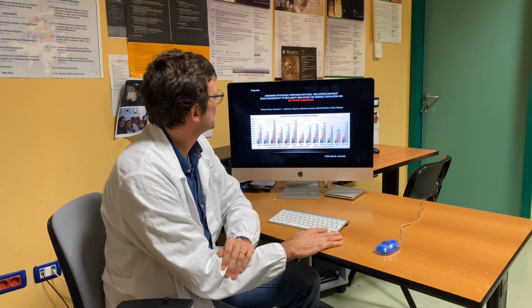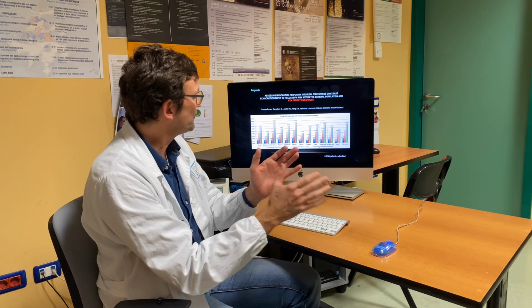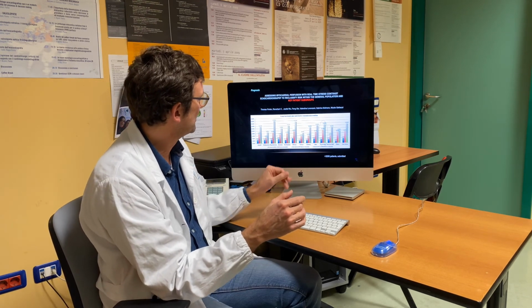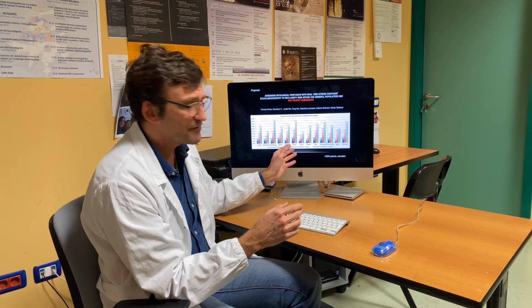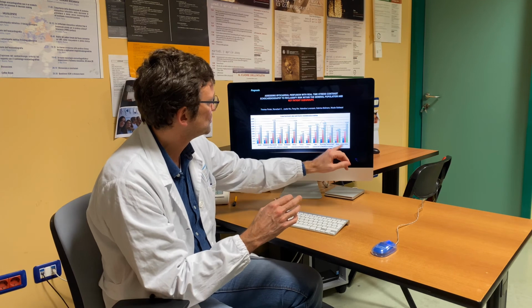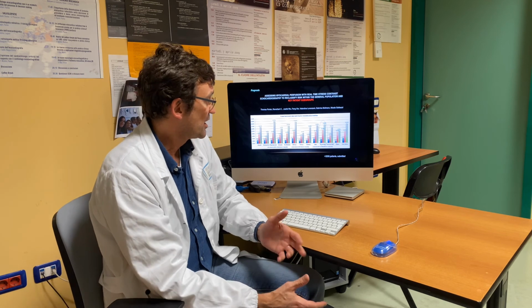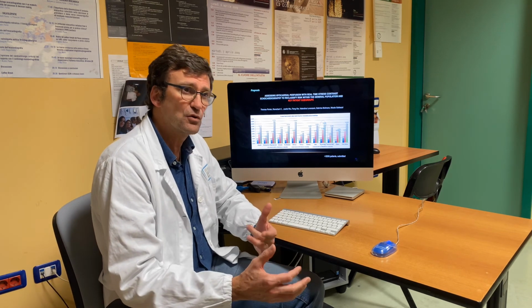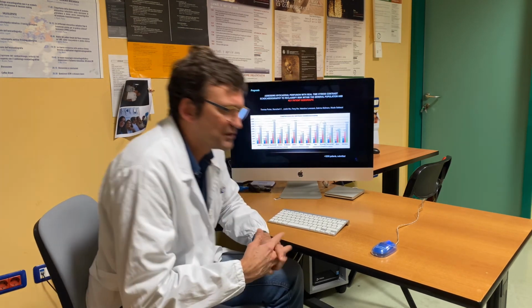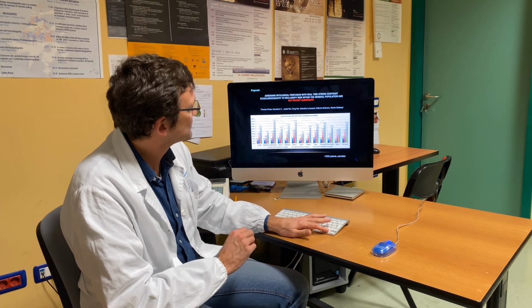This is, together with Tom, in more than 3,000 patients, we tried to analyze different settings regarding the type of stress echo, the stressor, which is dobutamine and dipyridamole, and several significant subgroups: diabetes, age, women and men, so gender, and history of CAD, obese or non-obese patients, which is questionable. In fact, in obese patients you could study perfusion, but in particular, Dr. Roxy Senior's group studied this issue. So in each and every subgroup, you're able to study this.